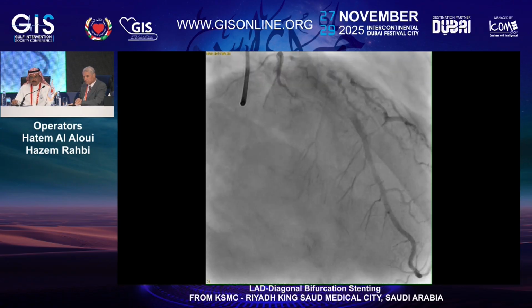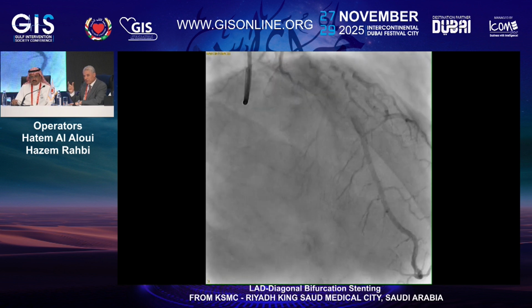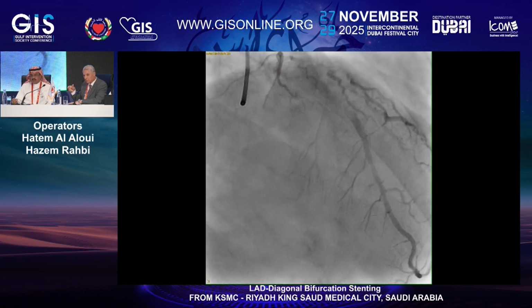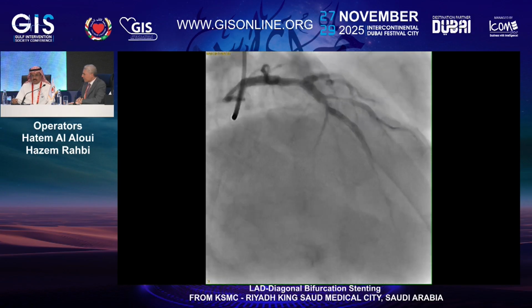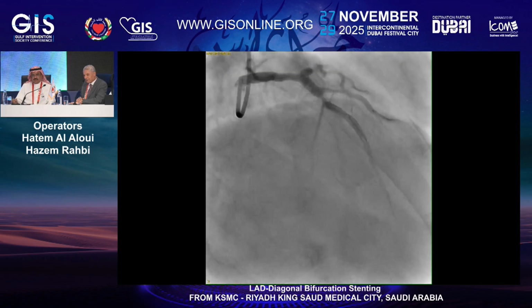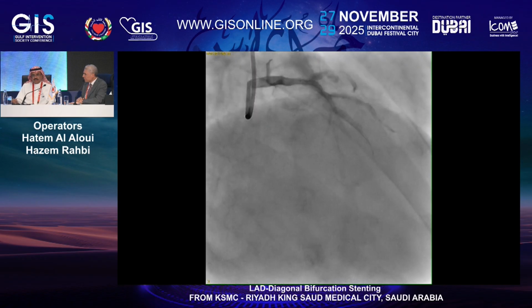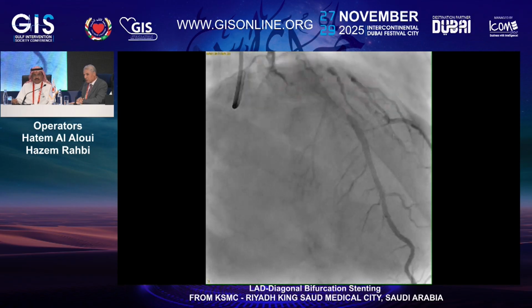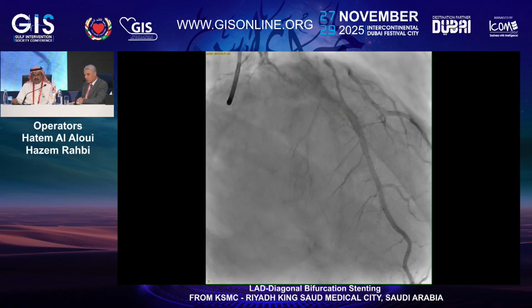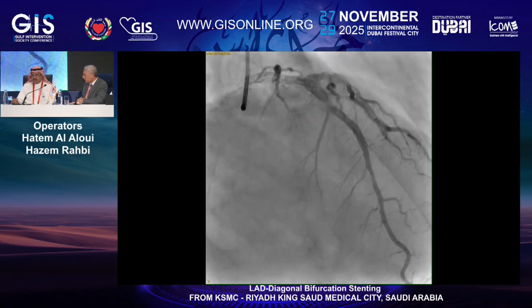Now, the question whether it would be a hybrid approach with stenting of the LAD and DCB for the diagonal, this obviously depends on the experience of every one of us. My personal approach is to maybe start to prepare the lesion with a balloon and see how it looks. If it looks fine, then a DCB would be appropriate. Otherwise, it will be a second stent to be placed in that lesion.